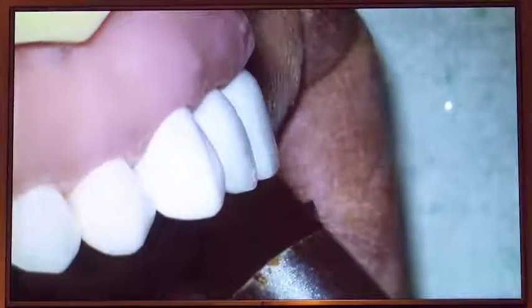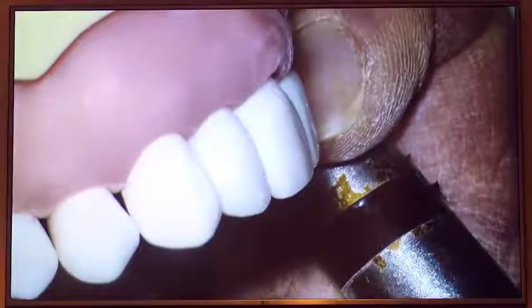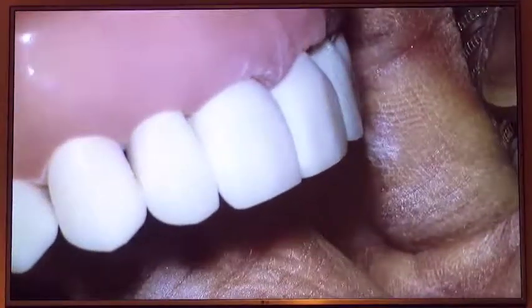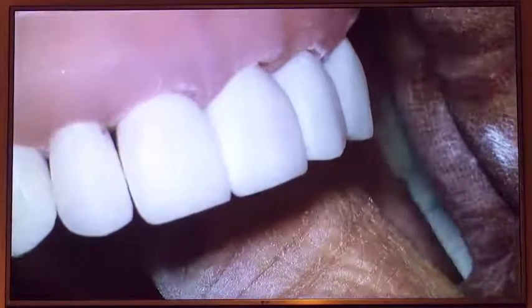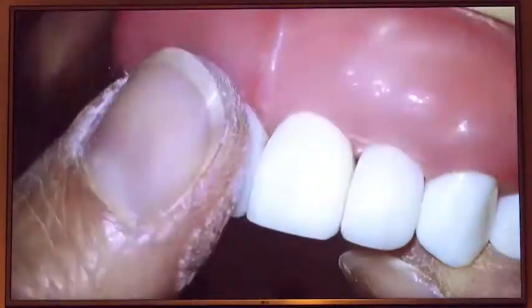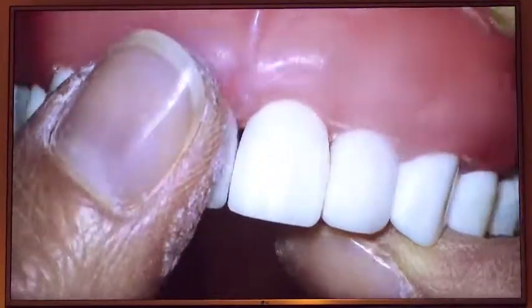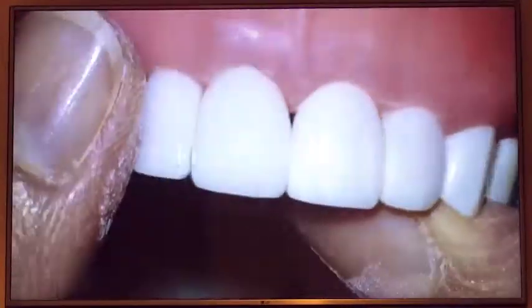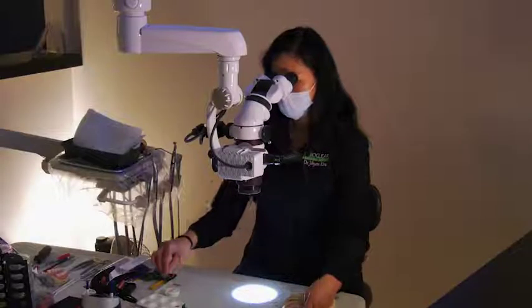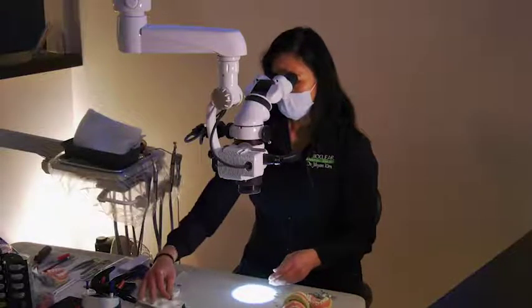From the side view, as the teeth roll around, you can see the setting. And then I want to show a difference between, here's the matte finish of a case with the surface undulations, and then here's with that case polished on the other side. I want to show the discs at various phases.